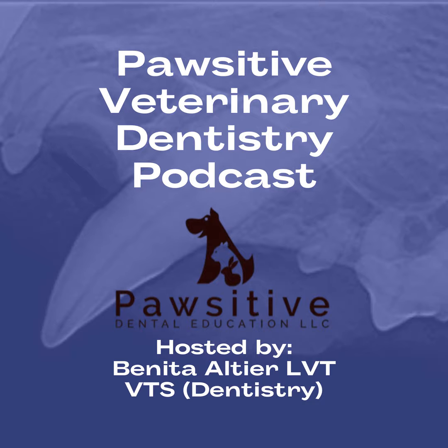And we have to not use labeling as a crutch. We really need to have a deep enough understanding of how images are acquired and what we're looking at on the screen to orient them properly before we even head down that path. I think that overinterpreting is a big theme of today.